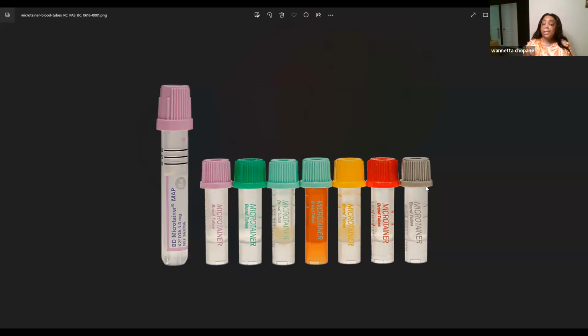The reason why is that with blood vacutainers, you're using a needle to go in someone's vein, so you have to go in the order of draw, like I said, so you don't cross-contaminate the additive. But in this case, the blood is dropping from the capillary puncture of the heel into the microtainer. So in that case, there's no need for order of draw.